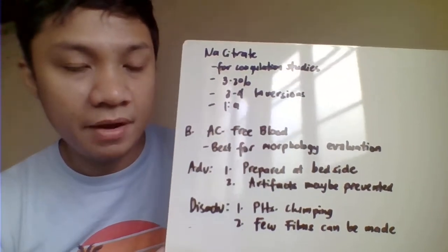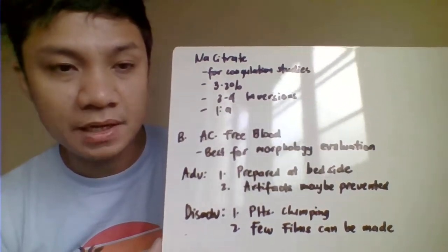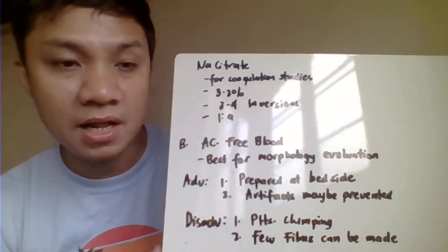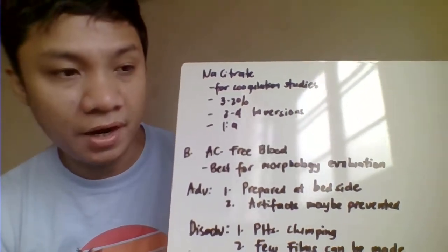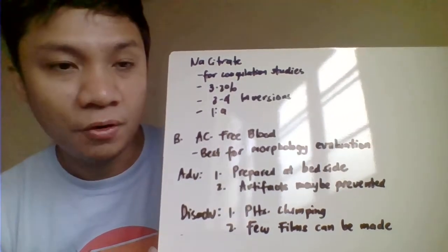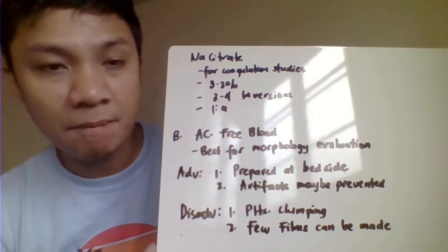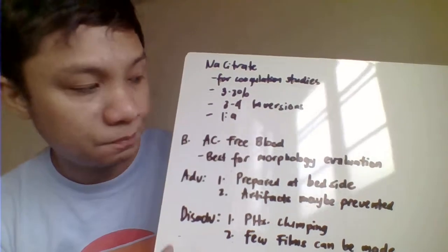Okay, then again, we have here your sodium citrate. So this is your light blue. Basically this one is used for coagulation studies. So this includes your prothrombin time and your activated partial thromboplastin time. So we have here the inversion, that's 3 to 4, with a buffered citrate would have a concentration of 3.2% or 0.109 molar. So the light blue top would have a 1:9 anticoagulant to blood ratio.